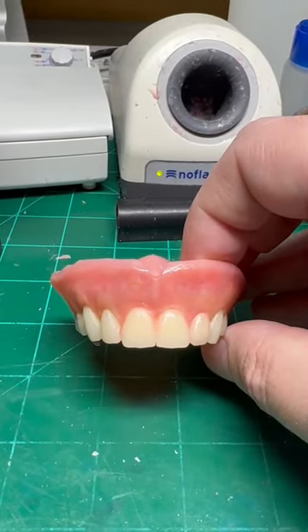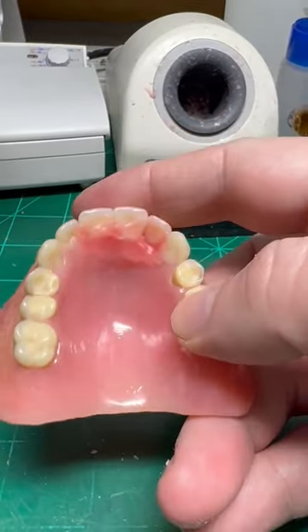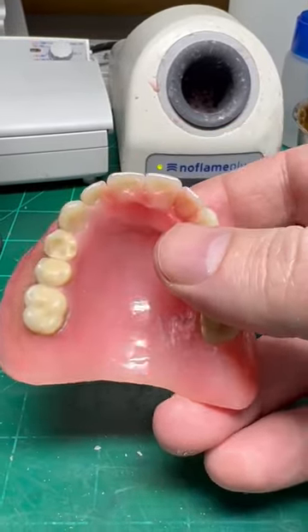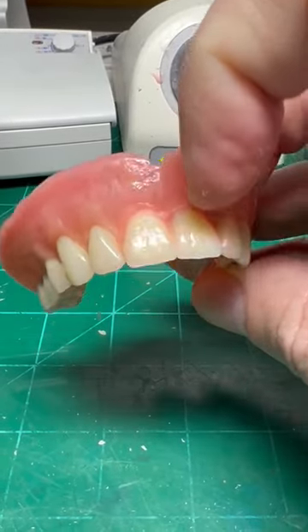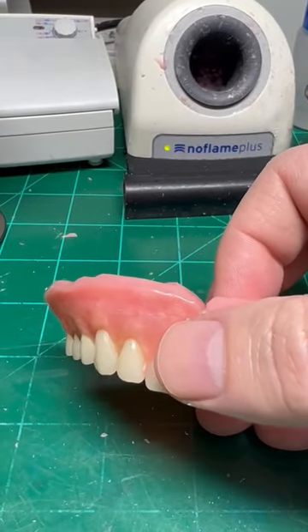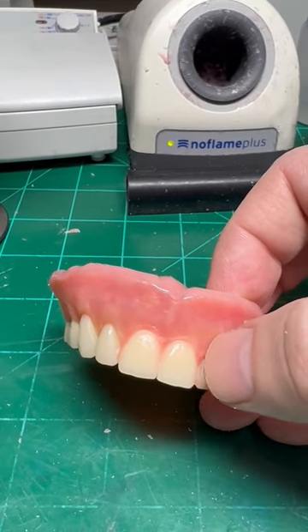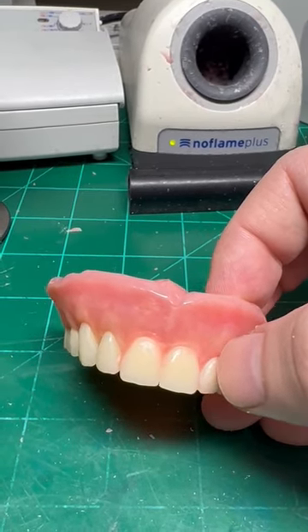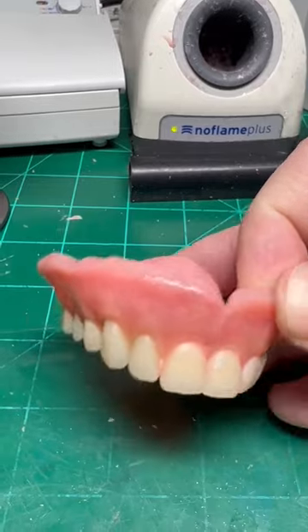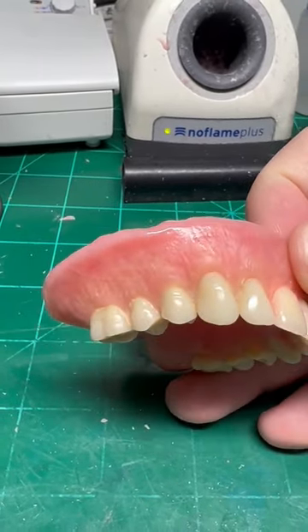Next step is I'm going to make a putty matrix to attach the teeth to, and now we're going to add acrylic from the palatal to attach the teeth to the denture. After that we're going to go back in and fix the composite in the front. I evened everything out, but I didn't make it completely perfect in this area because I'm going to be going back and grinding this composite just a little bit so I can add a little bit more to fix the margins.